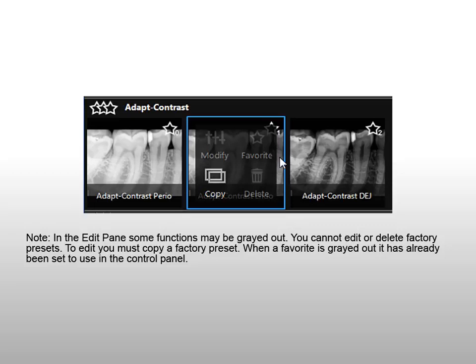To edit, you must copy a factory preset. When a favorite is grayed out, it has already been set to use in the control panel.